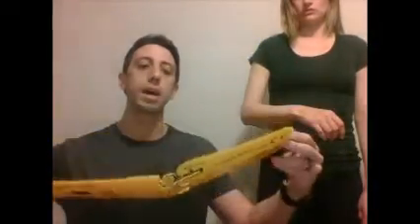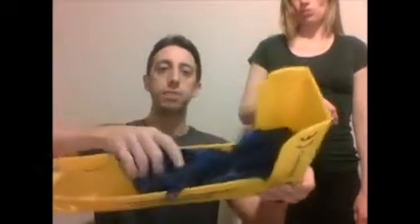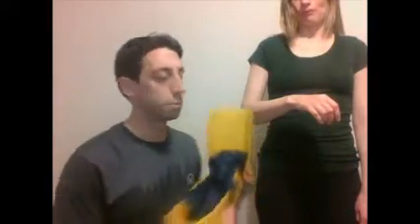To immobilize this particular injury, we have some options. They are commercially available. So you've got one that looks like this. It's kind of like a pizza box that you would fold up into position. There are instructions on how to do it on the product. If you use something like this to fit onto the injured site, just make sure that you pad the inside for added comfort. So you can see I'm just putting some bandages in there, or whatever you have to make it more comfortable. So that's one option that you could use.